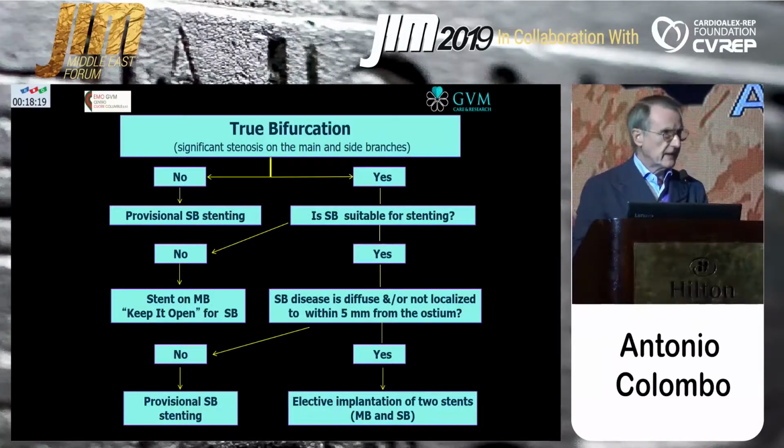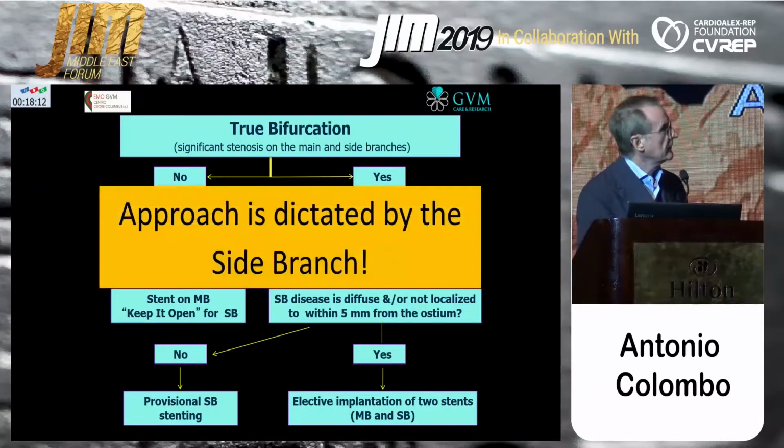I think this is all. I could finish my lecture here. There is nothing else to say: the side branch is a commander. So the approach is dictated by the side branch because you always place a stent in the main branch.